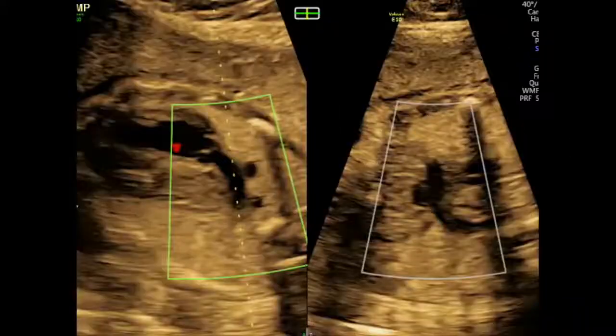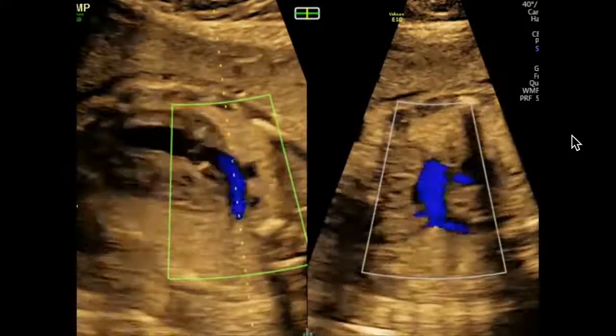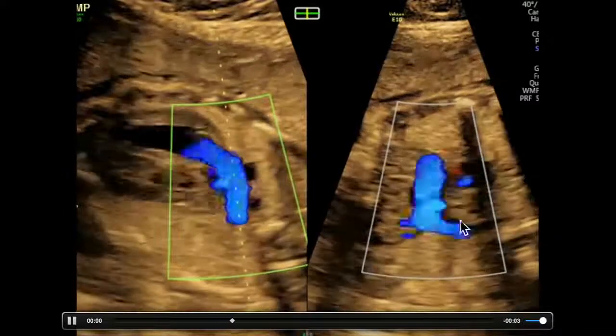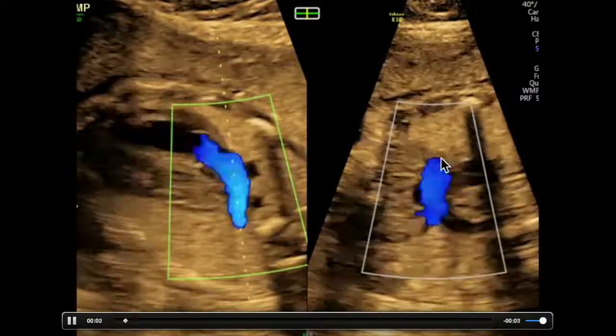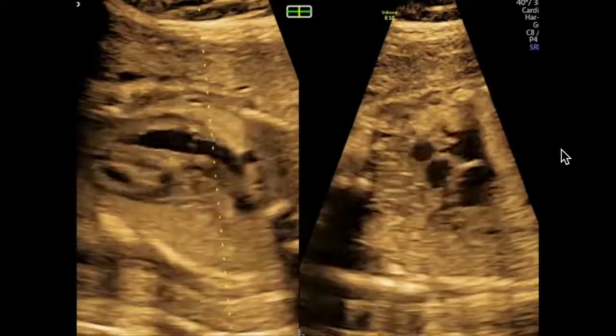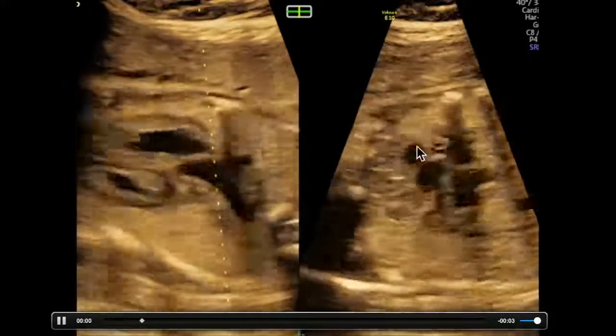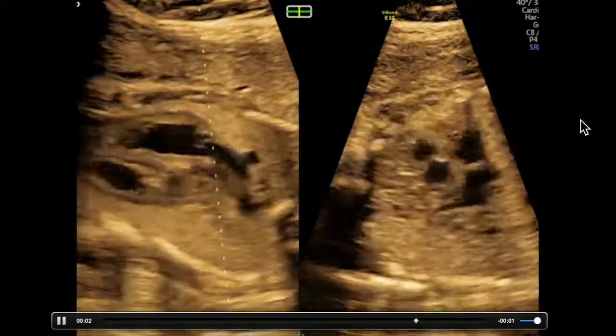but I could have easily gone back and done it exactly the opposite way. Here's looking at what appears to be an anteriorly transposed aorta coming out of the anterior right ventricle. You can see the head and neck branches prove that this is an aorta. And finally, looking at really the same case, if I just cut across the outflow tracts, you see the 2 parallel outflows that is diagnostic of TGA.